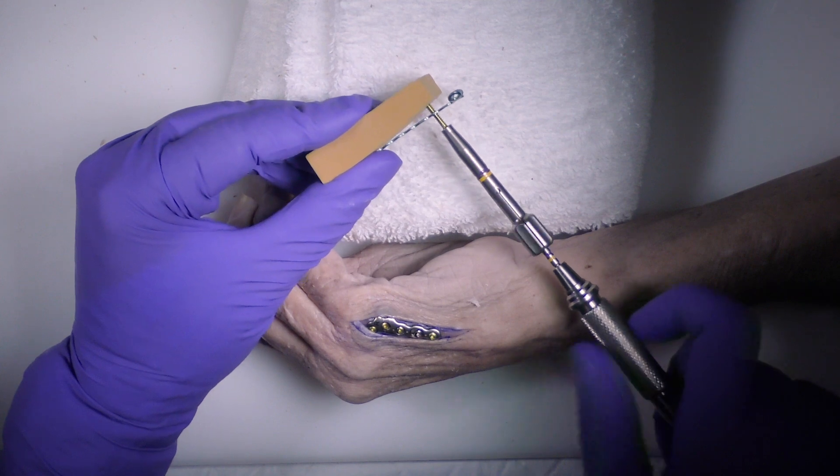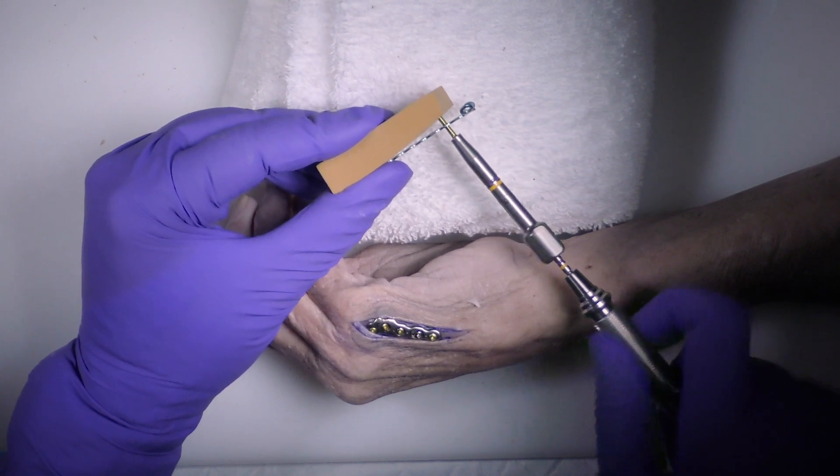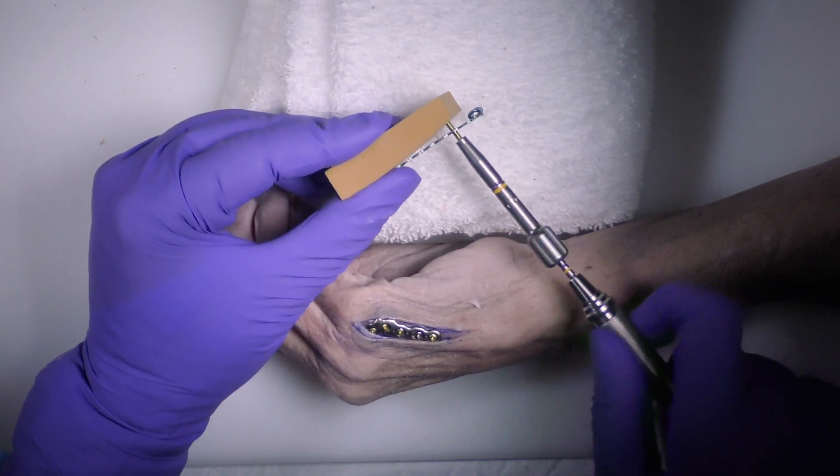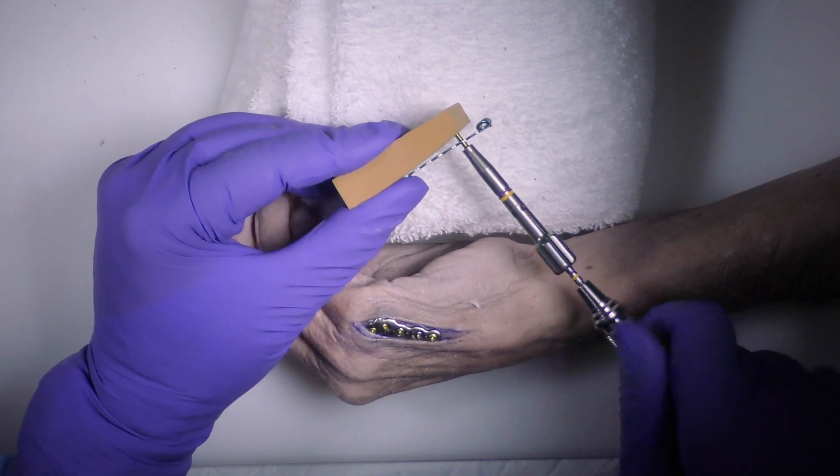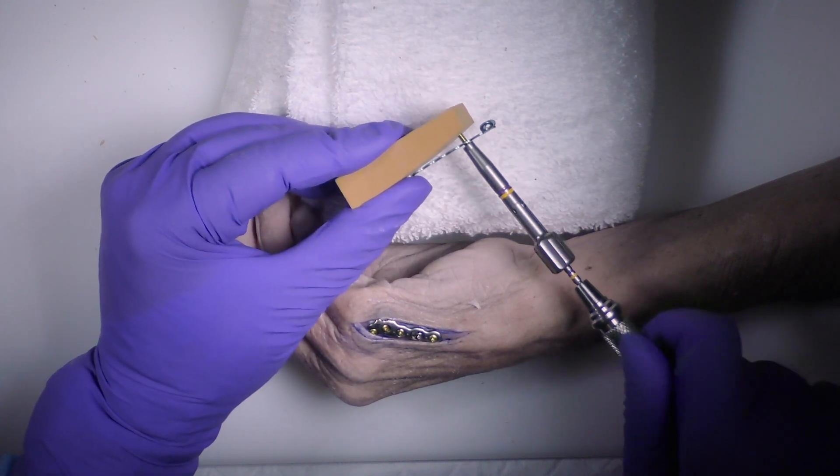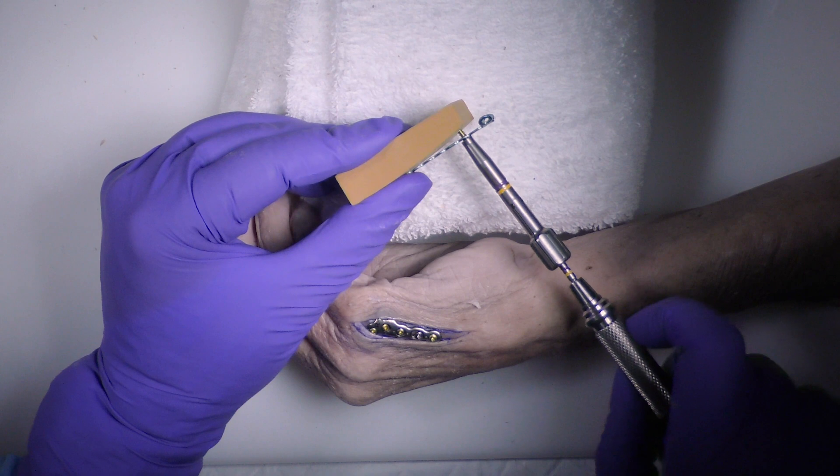We're using a locking screw right now, advancing this. If I don't have this save lock on the screw head, once the screw hits the plate, it'll lock right where it lies.